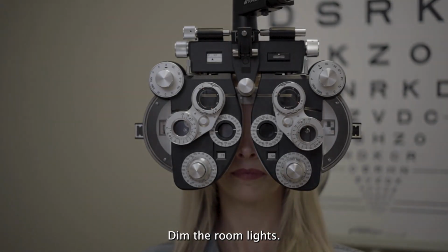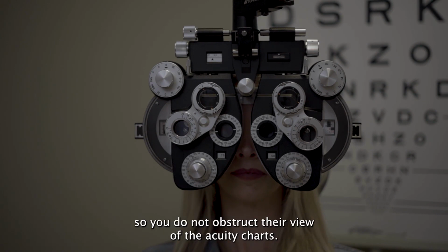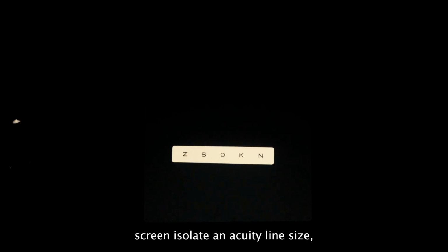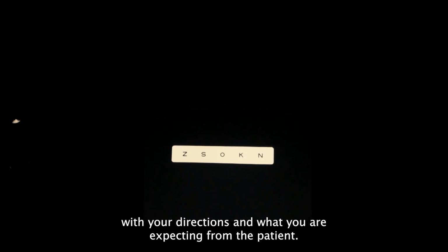Dim the room lights. Make sure you have the proper eye open and the other eye occluded. Sit on the side of the patient so you do not obstruct their view of the acuity chart. On the acuity screen, isolate an acuity line size, which is 1 or 2 lines above the smallest row read. Be very clear and concise with your directions and what you are expecting from the patient.